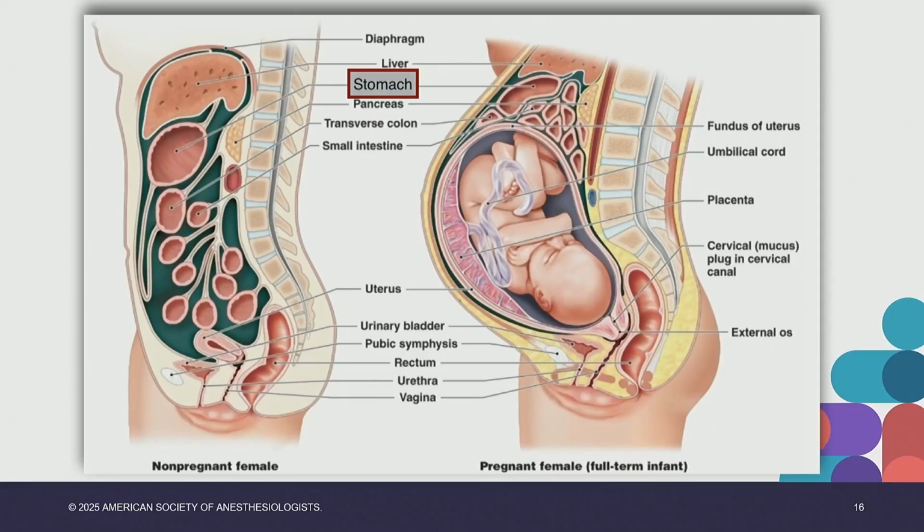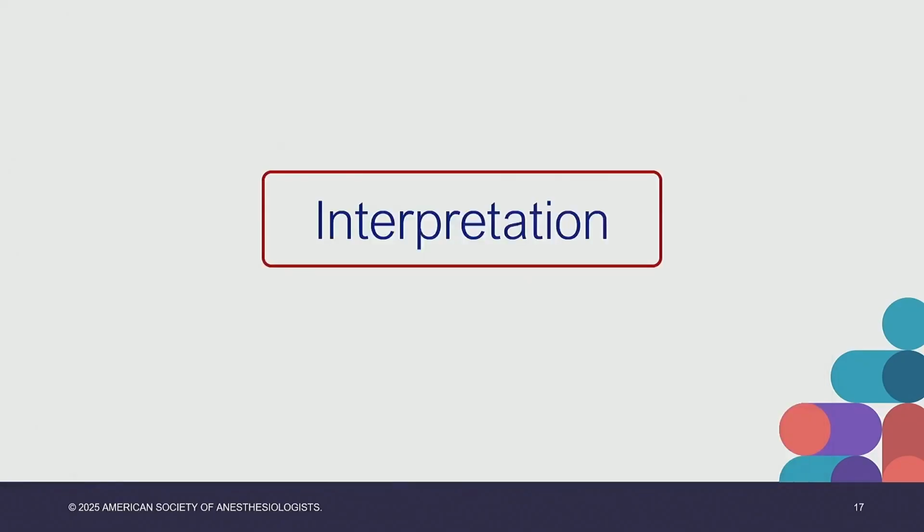Two positions, supine and semi-recumbent. With that, we may alleviate the supine aortocaval compression, but you need a slight manual displacement. There's fast and shallow breathing of the patient. You ask the patient to try to breathe slowly, but also hold the breath at end expiration. Probably the diaphragm is a little bit higher. You can take a picture and measure. So there is a change in the protocol.